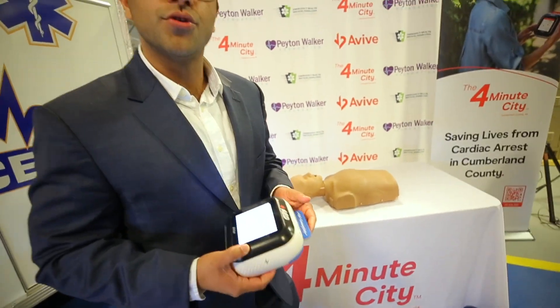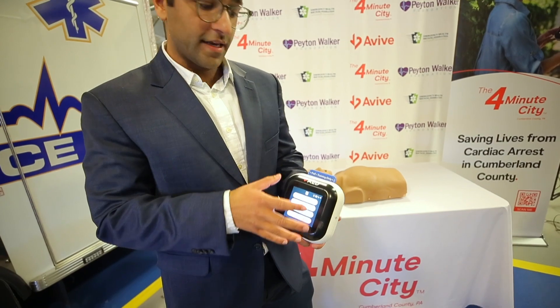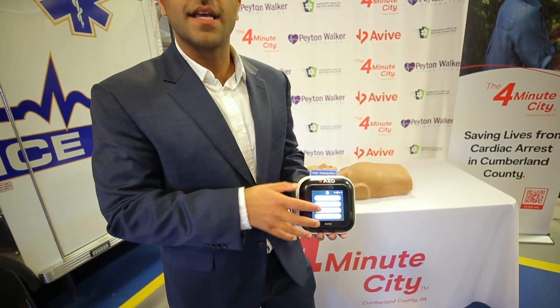The device is actually going to provide you with audio and visual instructions. So I'm not going to talk you through it. Instead, we're going to let the device talk and explain to us how you would actually save a life.